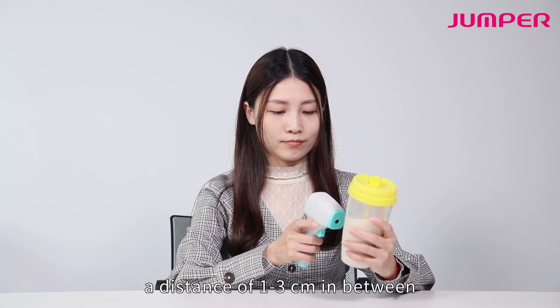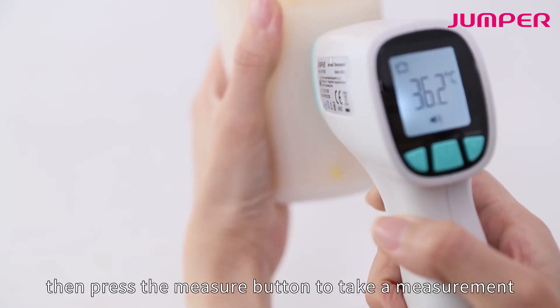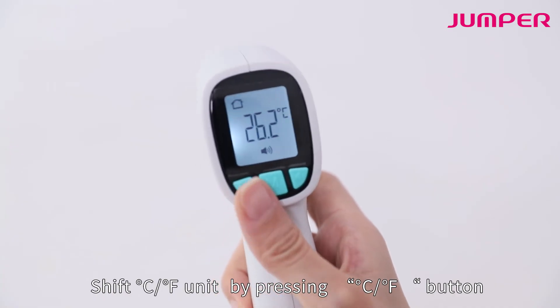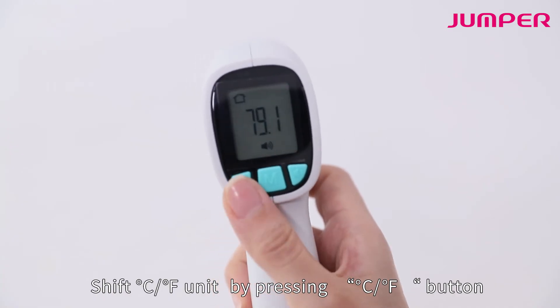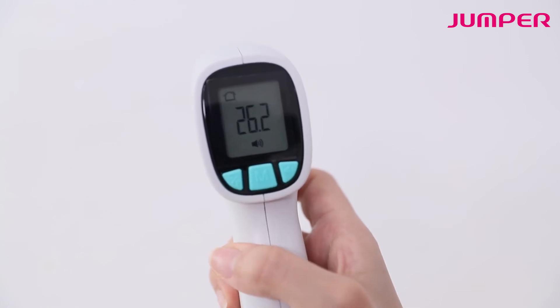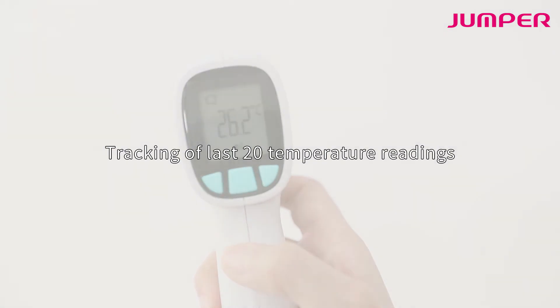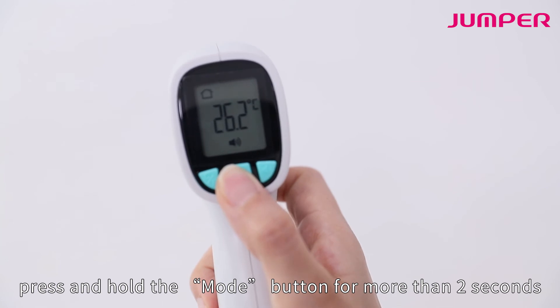Press the measure button to take a measurement. Switch between °C and °F units by pressing the CF button. Press the mute button for silence mode. The thermometer tracks the latest 20 temperature readings.